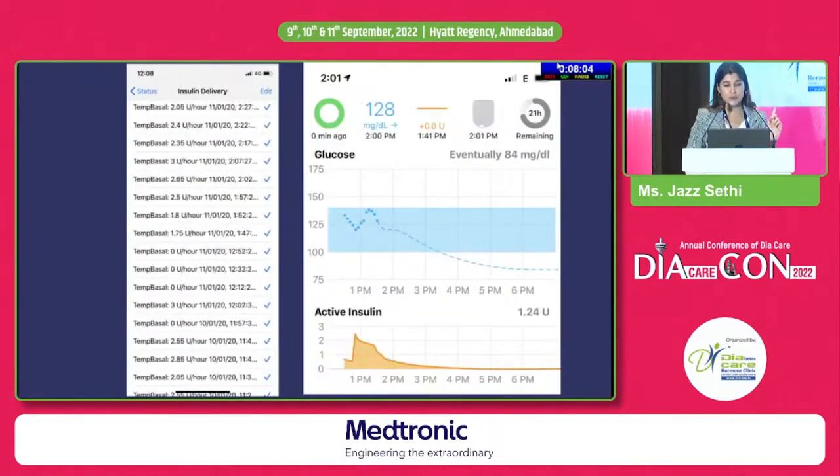This is what my dashboard looks like. In the insulin delivery view, every three minutes or so the temporary basal is changing — that is just not possible on a pump or on MDI. Every few minutes based on my values, the temporary basal is changing. When it says zero, that means it's suspended. So I was running high, it gave me more insulin; now it's coming low, so it suspended it again. It's absolute magic.